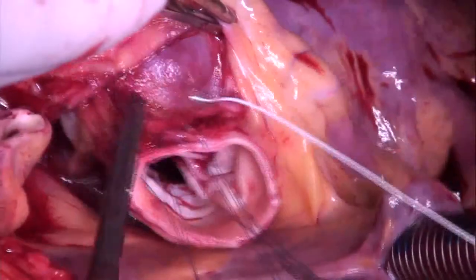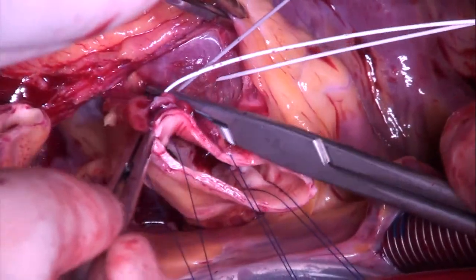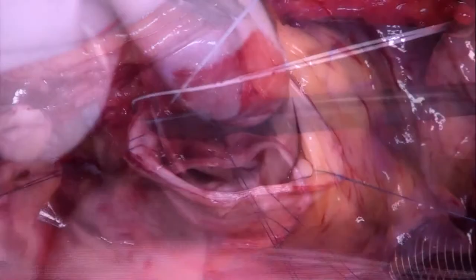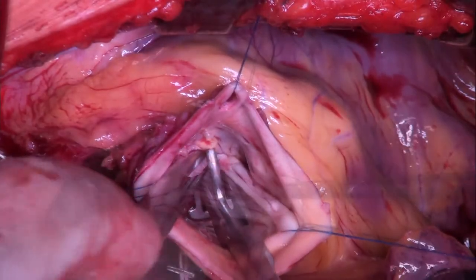A strong PTFE suture is now passed through septal muscle and posteriorly through the tunnel, and it is then tied around a Hagar dilator. This is more or less normal.